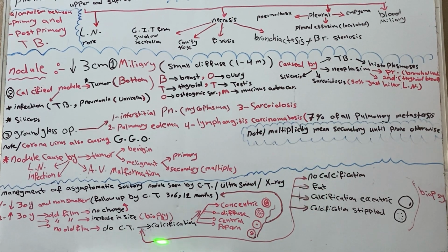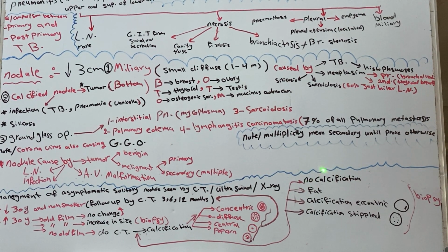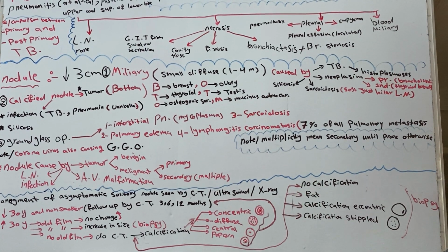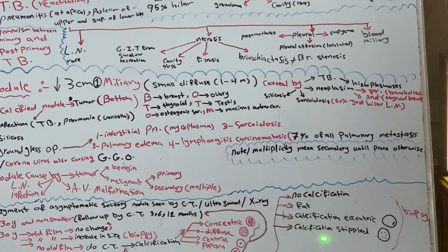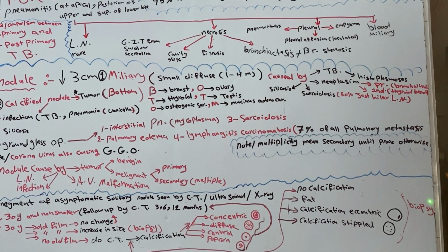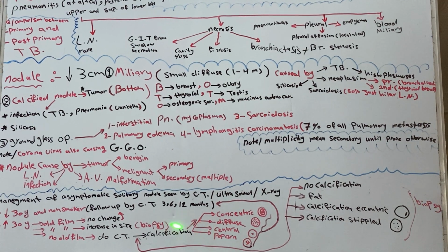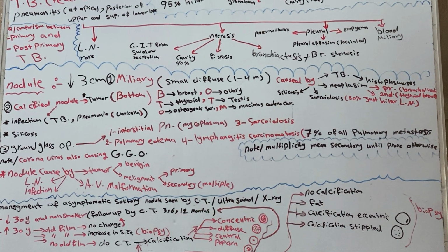Or by CT, no calcification of the nodule, or fatty tissue in the nodule, or calcification eccentric, or calcification is stippled, so do a biopsy. The others need follow-up.